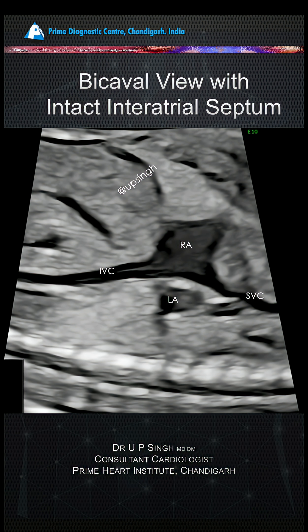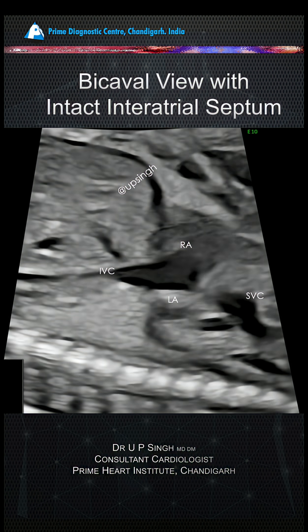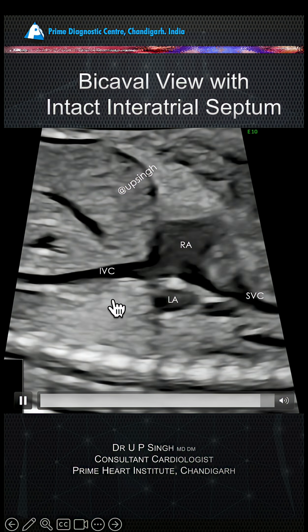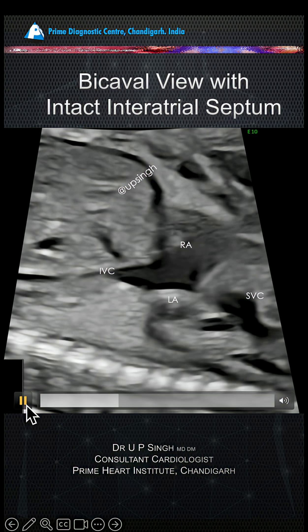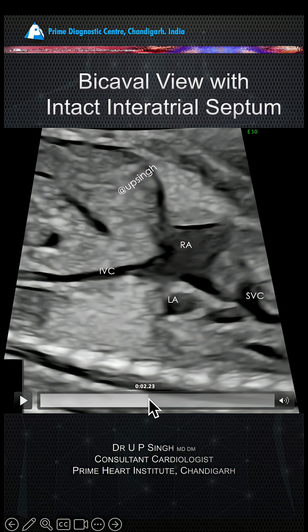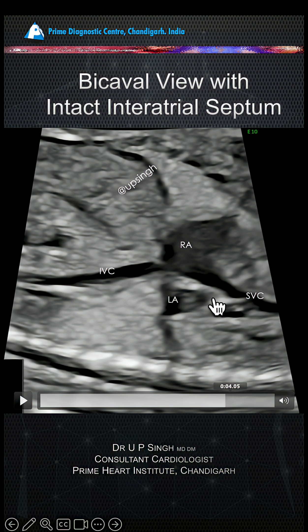Sinus venosus ASD in the fetus. This is the normal bicaval view with intact atrial septum. You can see the atrial septum here — there is an inferior vena cava, this is the superior vena cava entering into the right atrium, this is the right atrial appendage, this is the left atrium, and this is the interatrial septum.